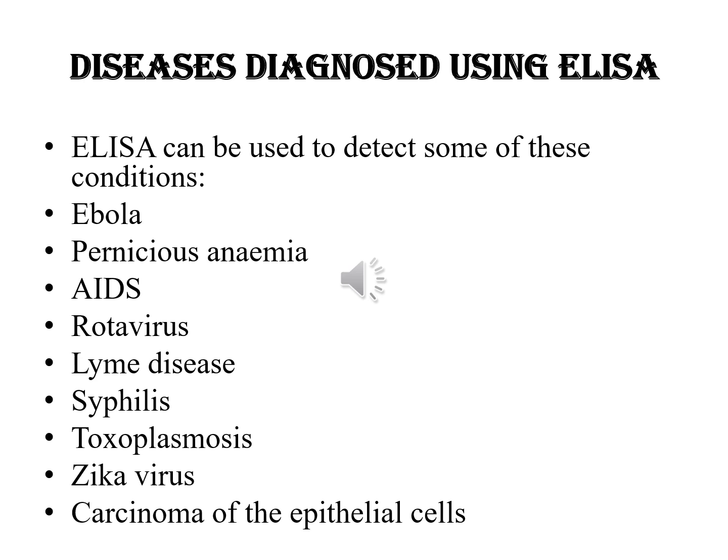Advantages of ELISA are: it is easy to identify a particular kind of disease. It is a rapid test which yields results quickly. It can be used on complex samples as the antigen is not required to be purified for detection. It is highly responsive since direct and indirect analysis methods can be carried out. Possible detection for ELISA ranges from quantitative, semi-quantitative, standard curves, qualitative, to calibration curve models. It is easier to perform and uncomplicated as compared to other assays, which require the presence of radioactive material.